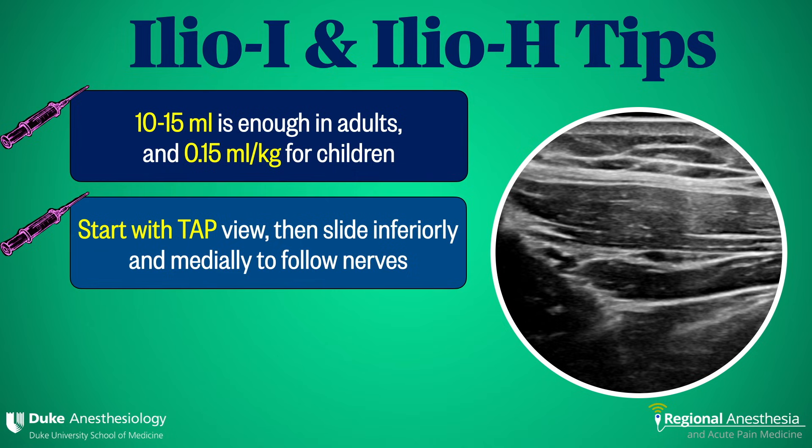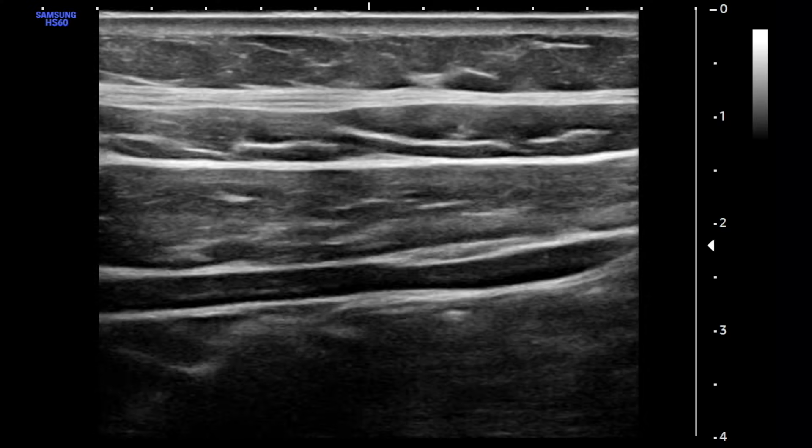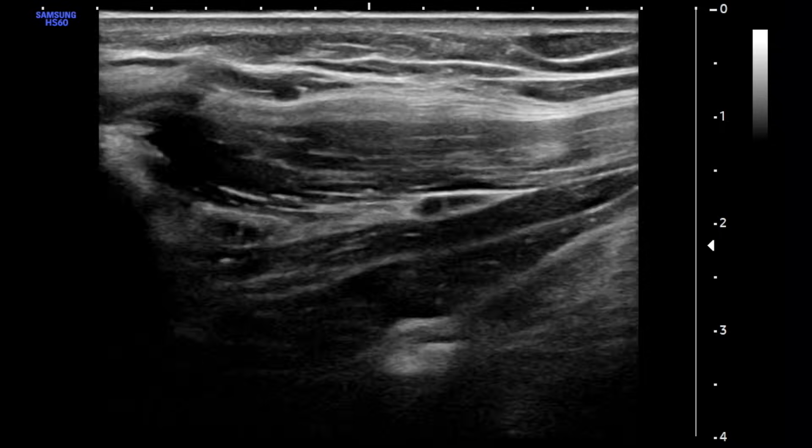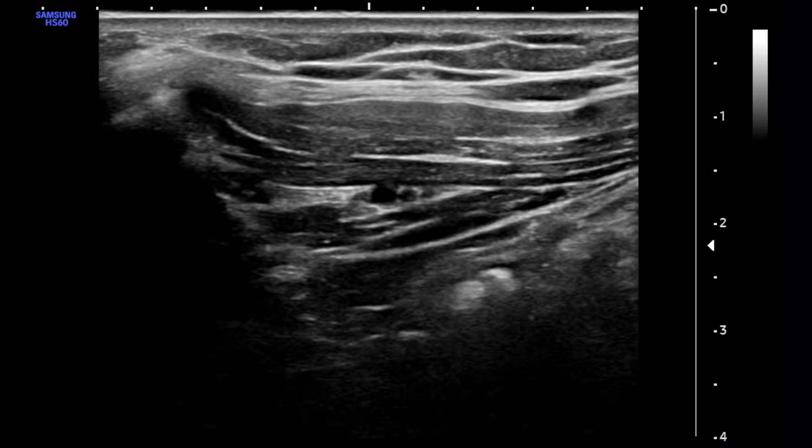In individuals with challenging belly contours, it's often helpful to start scanning at the TAP position above the ASIS, identify the three muscles, and then slide medially and inferiorly until the target nerves come into view. Here we see the three TAP muscles. As we slide, the nerves become quite obvious and, more importantly, it's clear which muscle layers are which.